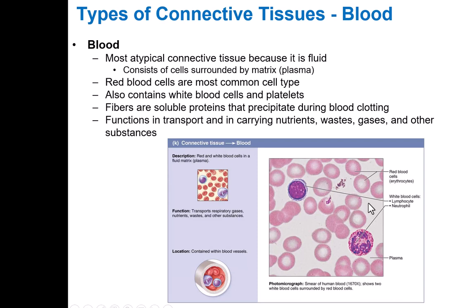They do not have a nucleus. If you were looking at adipose tissue, one, they would not stain pink, and two, you would see nuclei pushed up against the edge of those cells. You don't see that here. You see red blood cells, and then you'll see a few darker purpley staining cells. Those are white blood cells. So again, this is a very obvious type of tissue.